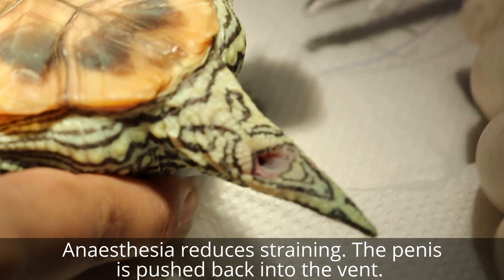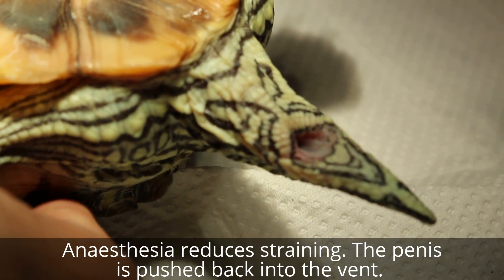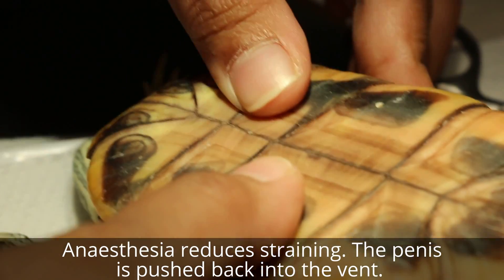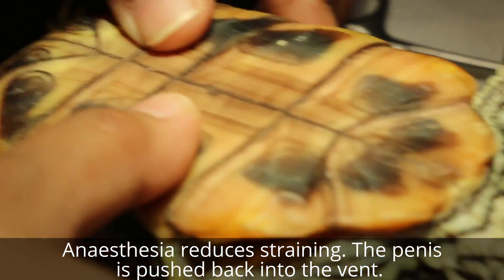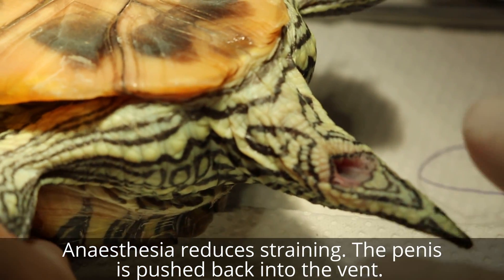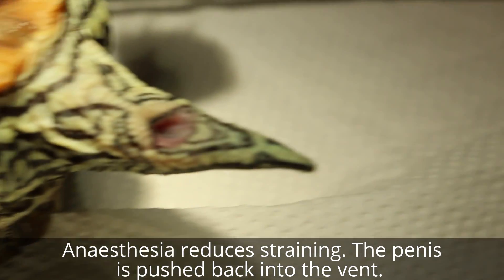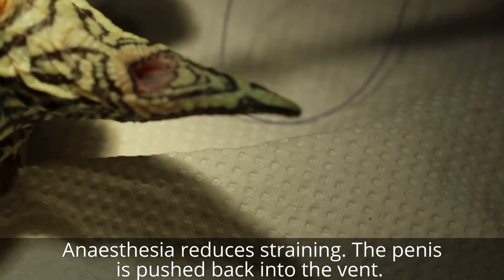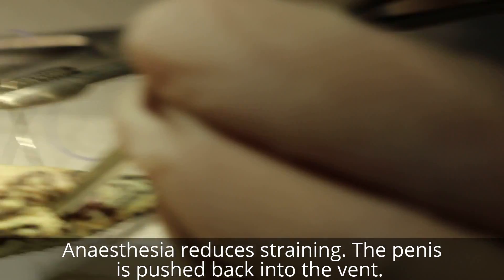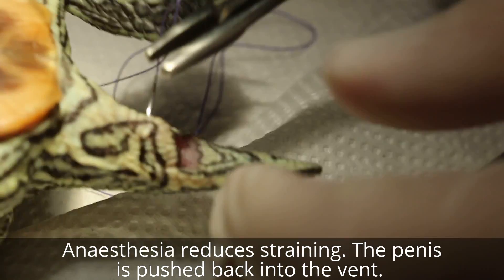So take it out quickly if it's not moving too much, otherwise it might die from overdose. So now it's okay. Put in some more gas again because it's moving again.